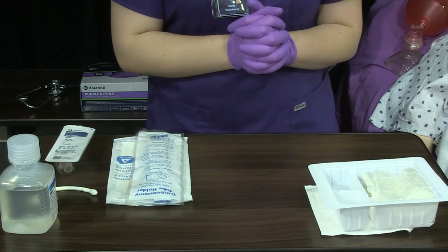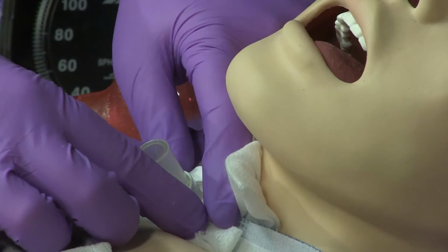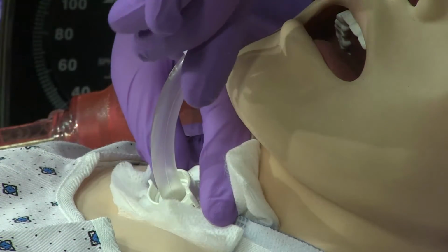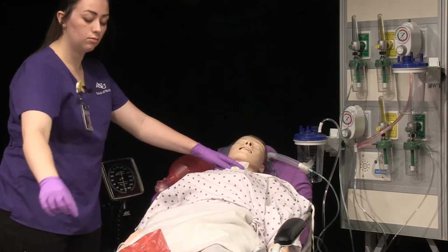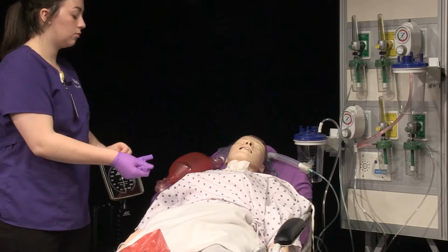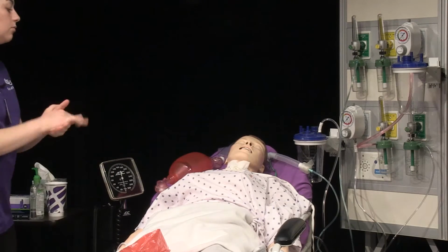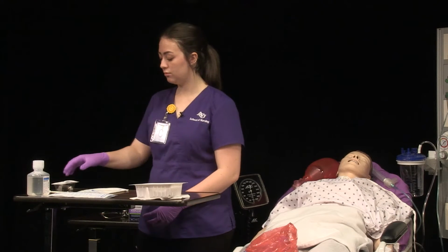Remove inner cannula. All right, I'm just going to remove the inner cannula. Stabilize faceplate with one hand. Twist inner cannula to unlock it. Pull the inner cannula up and out and dispose of inner cannula per facility policy. Remove and dispose of gloves and perform hand hygiene. Prepare remainder of supplies from kit.